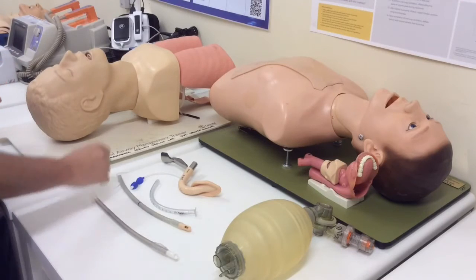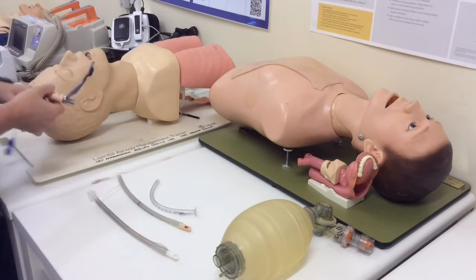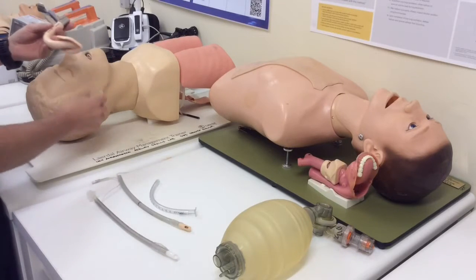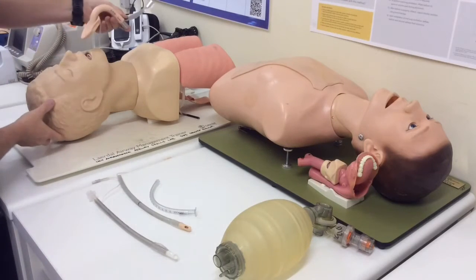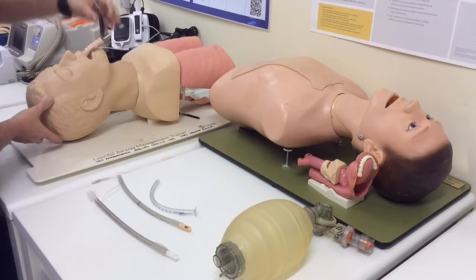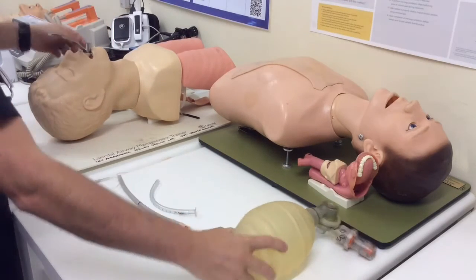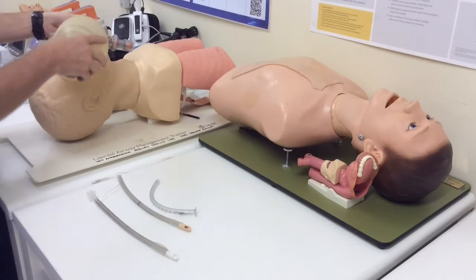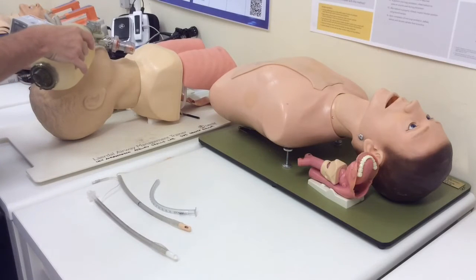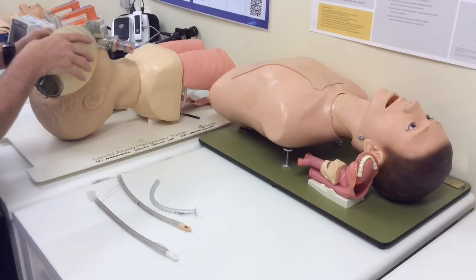So, in my situation, my difficult airway, perhaps the sats are dropping, perhaps I've failed my intubation, I'm starting to panic, I grab my Fastrach, cuff deflated, well lubricated, inserted like I've been describing with all the other supraglottics, following the curvature of the airway, in it goes, and immediately I can connect my ventilation, I can inflate my cuff, and I can see, am I able to ventilate? There we go. I'm oxygenating my patient, sats are coming up, my heart rate is coming down, and now I can relax and start to think about my next move carefully.